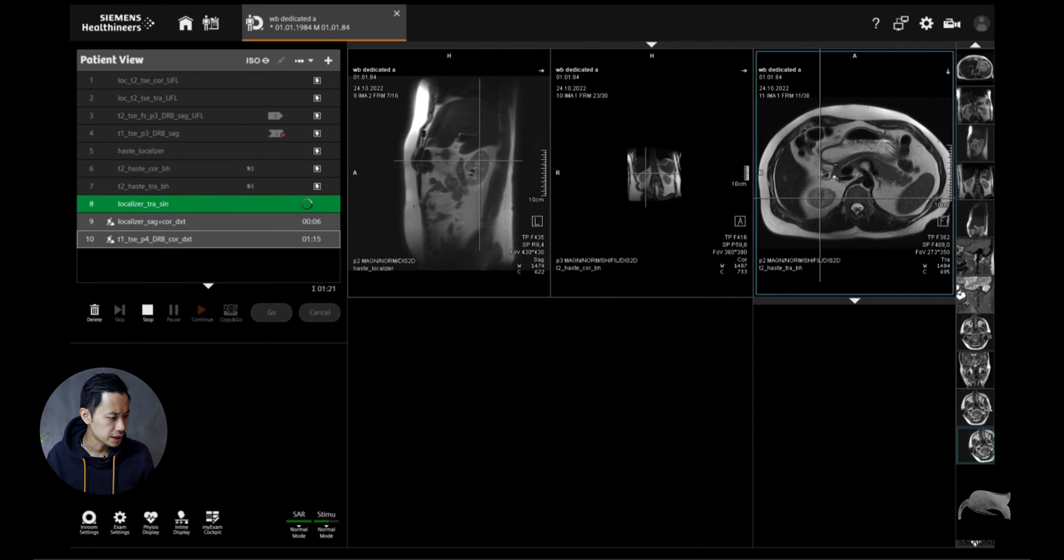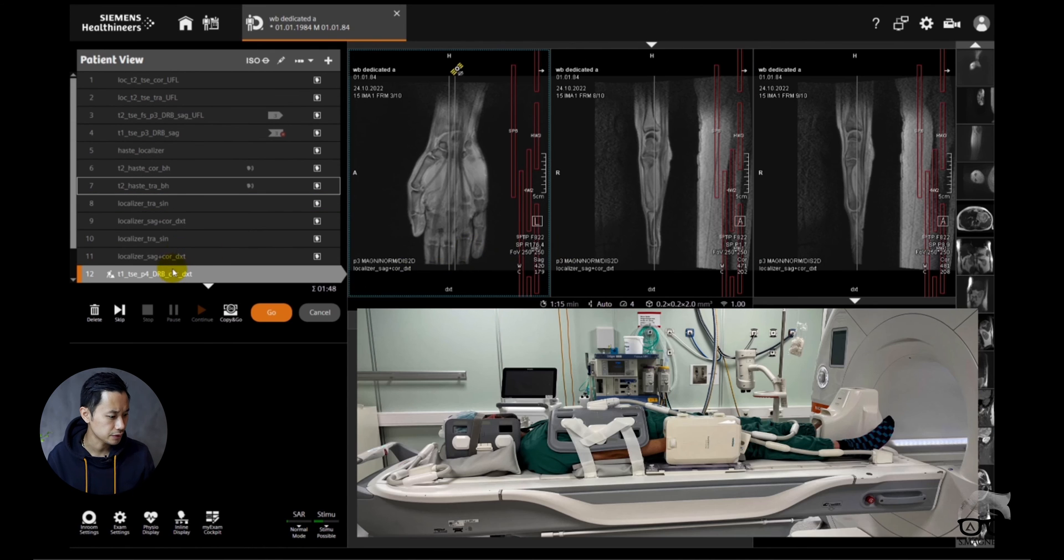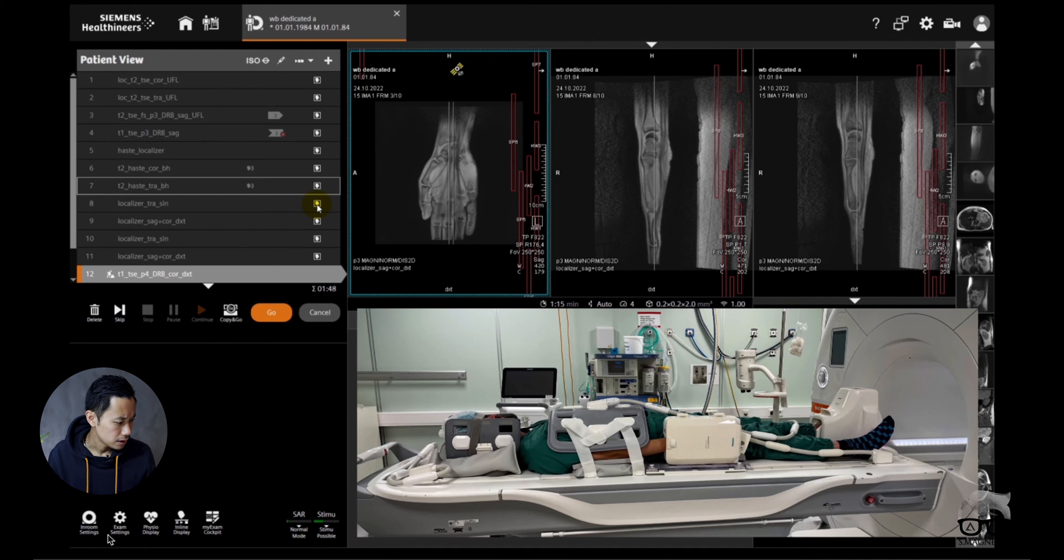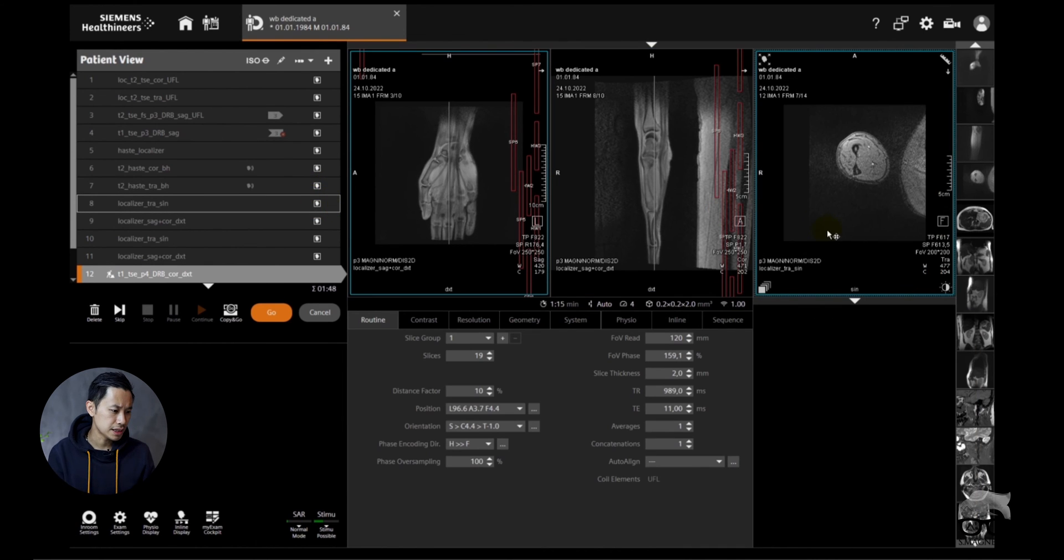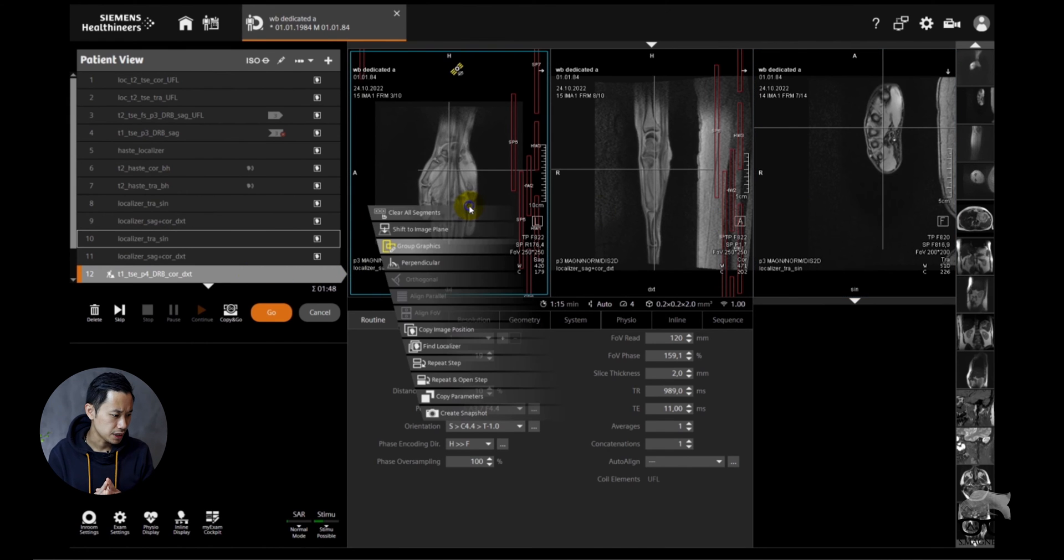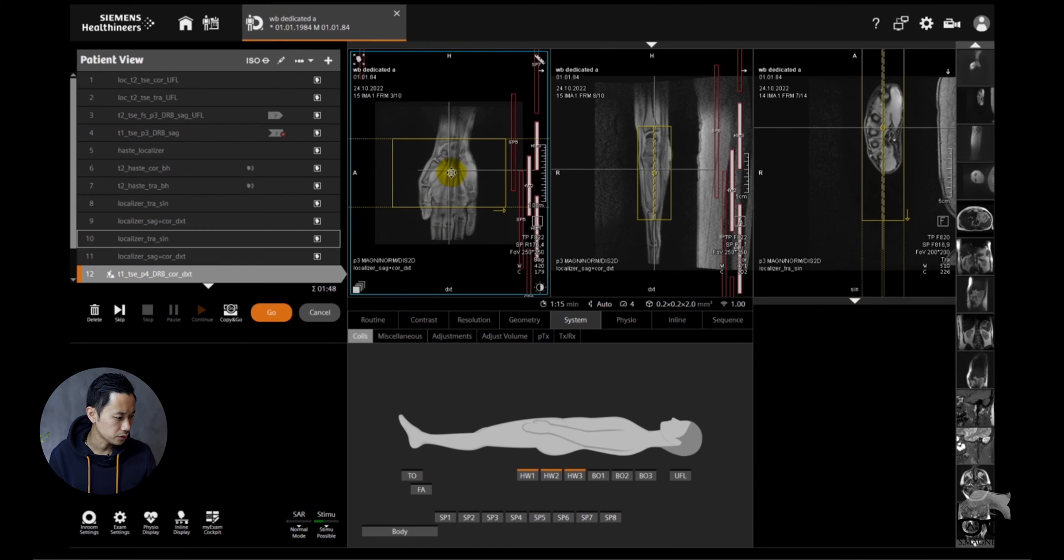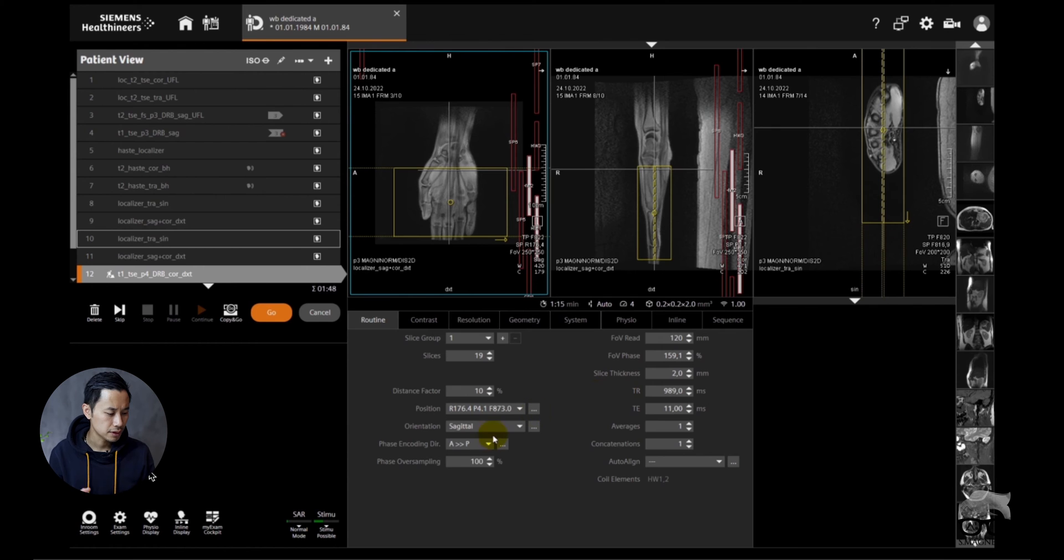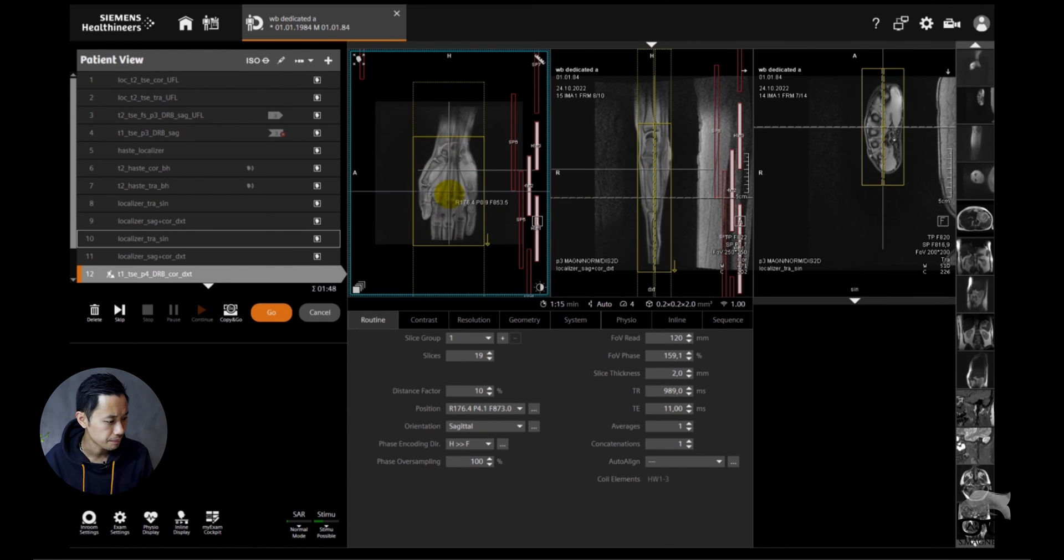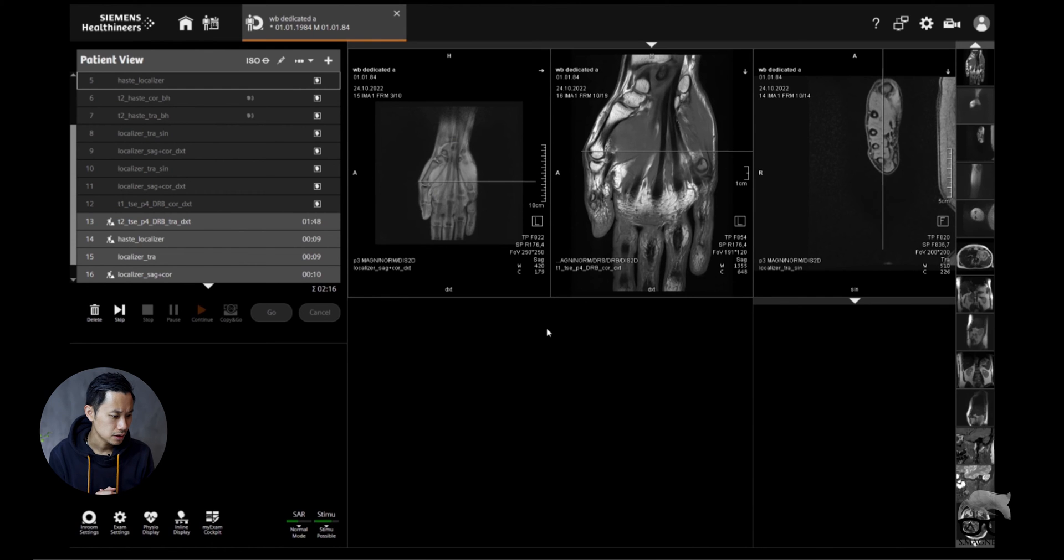After that we did a new localizer further down to the hand wrist. The hand wrist is covering the right hand right there. As you can see here, if you have good localizers it's easy for you to do the positioning. We did a few sequences for the hand wrist just to get some images and show you if it works. You can see the auto coil is on, so it automatically detects the coil. It's important to have the coil elements on wherever the organs you are at. We're just covering the whole hand there, and of course going to show some images later.